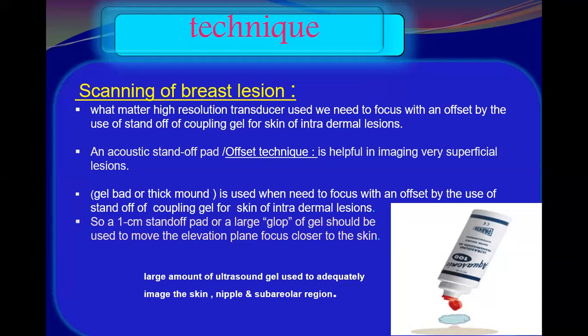That means the near zone or the narrow zone, yes, it's near, but it's not as near as the level of the skin lesions. If you remember the image, sorry, I did not bring it here again. The narrow zone of the transducer is where I could see the lesion very sharp.